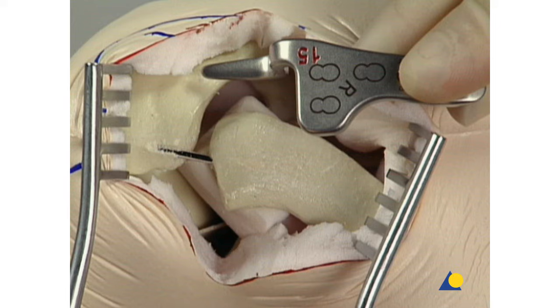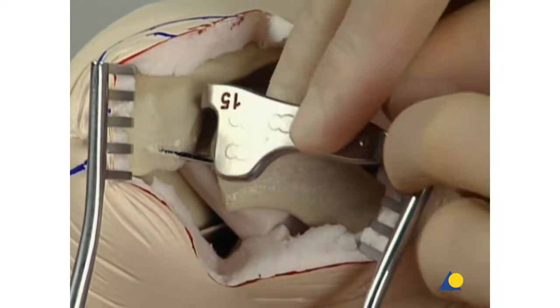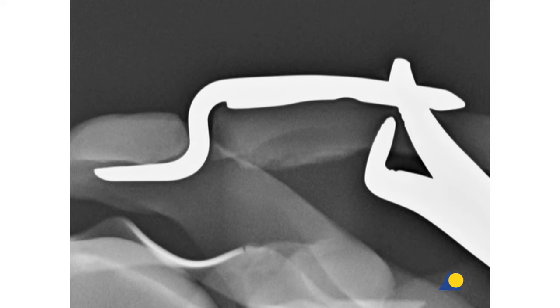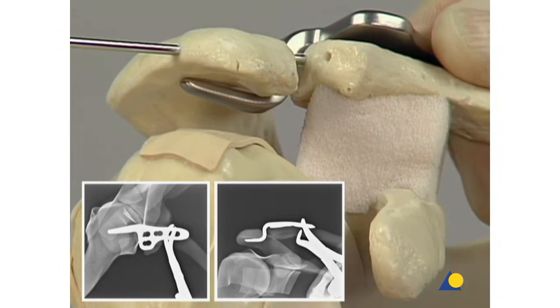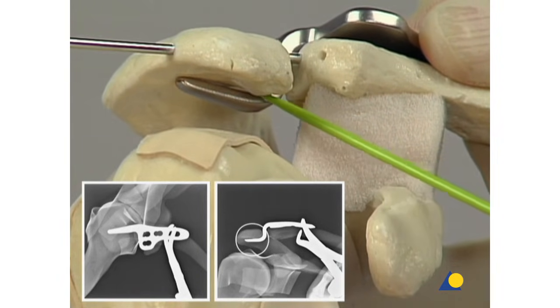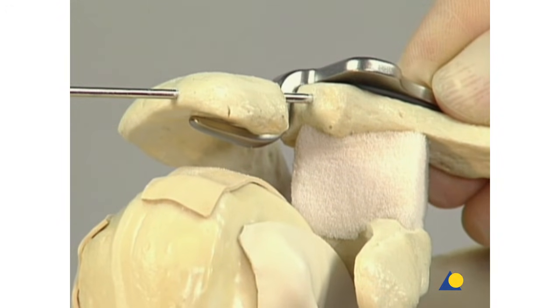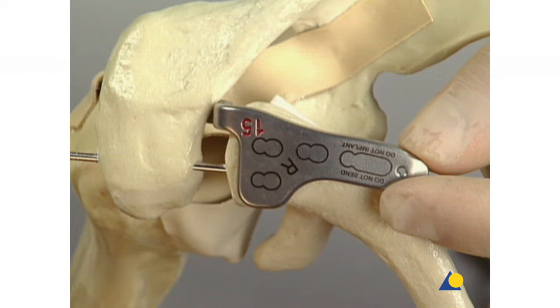In this case, the trial implant with a 15 mm hook is used to demonstrate the technique. In the clinical situation, the choice of the trial implant should take into account the size of the patient. The hook of the trial implant is passed under the acromion and the shaft of the trial implant is placed on the superior aspect of the clavicle. If it is difficult to lower the shaft onto the clavicle, then an implant with a larger trial hook should be used. An intraoperative x-ray control is made to verify that the hook size is correct. Once the plate shaft is placed on the clavicle, the entire surface of the hook must be in contact with the underside of the acromion. It must be confirmed that the correct anatomic alignment of the clavicle and acromion has been restored without impinging on the rotator cuff.